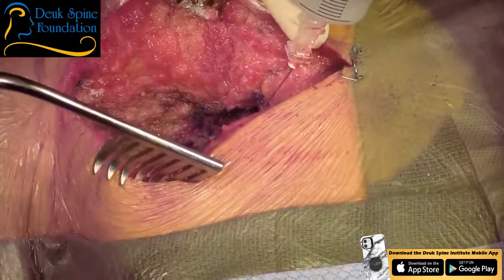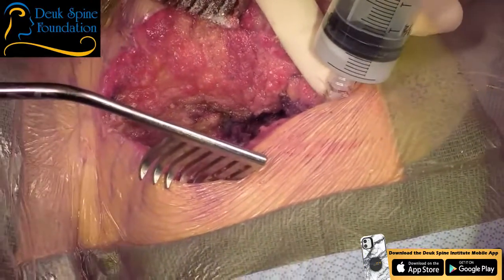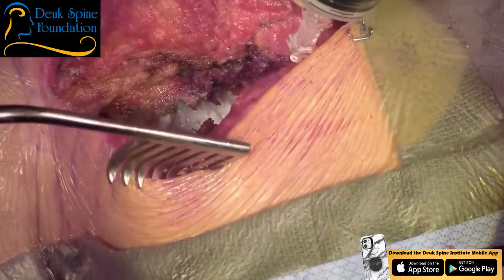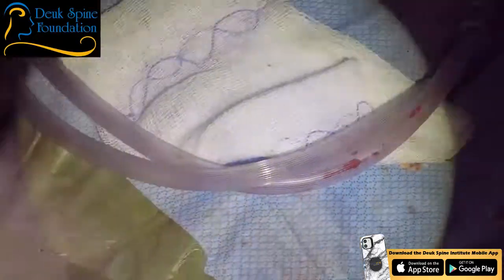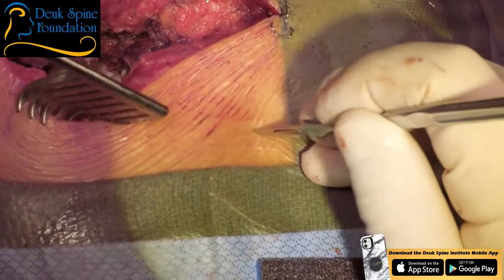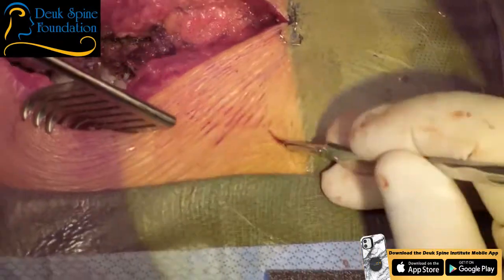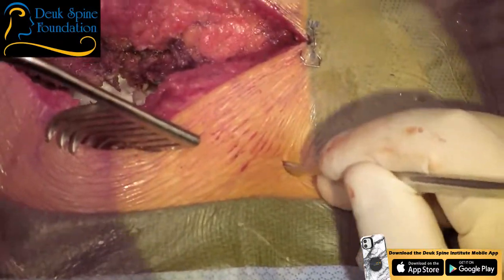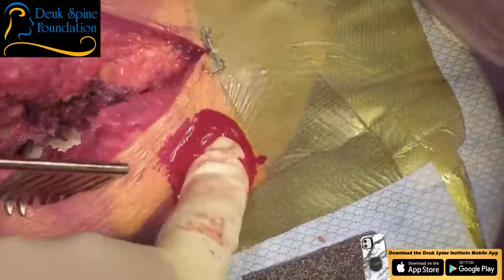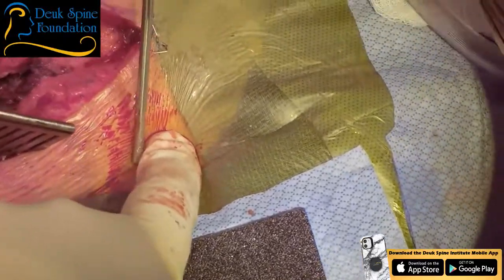Careful with your staples here. How are you doing? All right, now we're gonna start closing. We're gonna put a drain in. You got the drain ready? All right, let me see. You got it? Okay, good. 15 blade. So I'm going to make a puncture with the 15 blade lateral to the primary incision, and I'm going to make it big enough to get the waist of this thing in. Okay? Of course. Suck, please. Everything wants to bleed today.